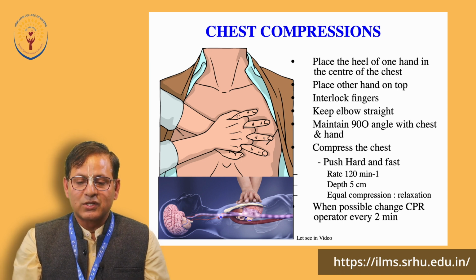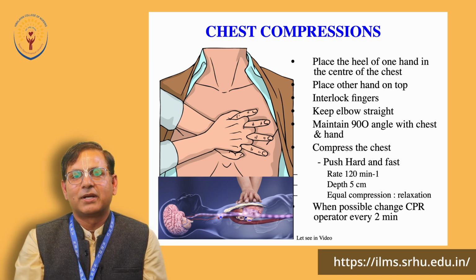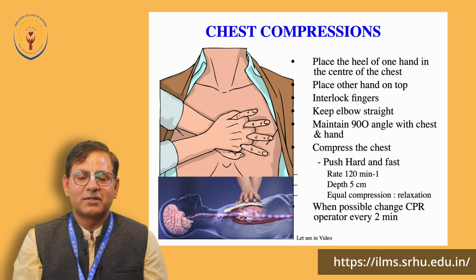When possible, change CPR operators every 2 minutes, because sometimes the person who is giving the CPR may also get tired. In that case, he should be changed within 2 minutes, because it is important to give quality, or high quality, CPR to the client. Now we will see in the video how we can perform these chest compressions in a proper manner.